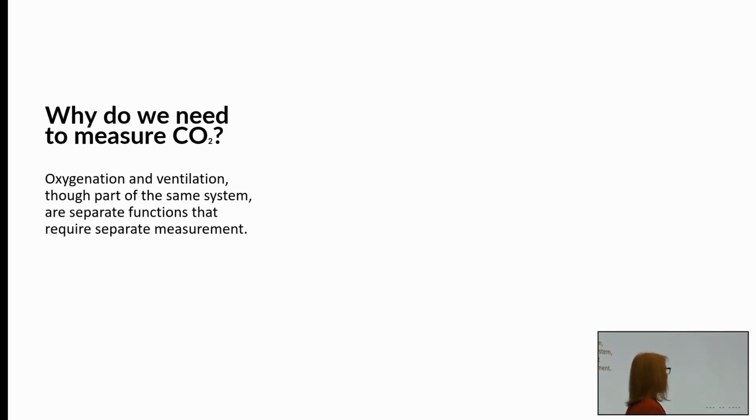But let's talk about why we need to measure CO2. We monitor oxygen, and we understand the importance of monitoring oxygen, and it's an easy value to get. You put a pulse oximeter on, and you've got your oxygen values. When I first started, it was actually 30 years ago, and anytime we needed an oxygen saturation on a patient, they'd call the RT. Not so much anymore. Now you can order it on Amazon and find out your oxygen saturation, right?